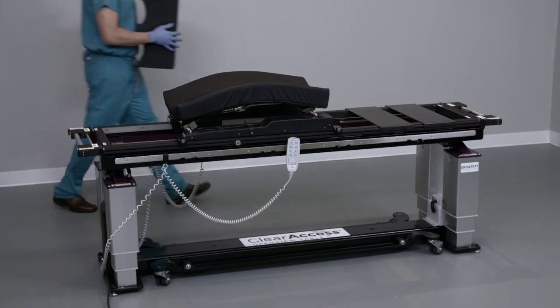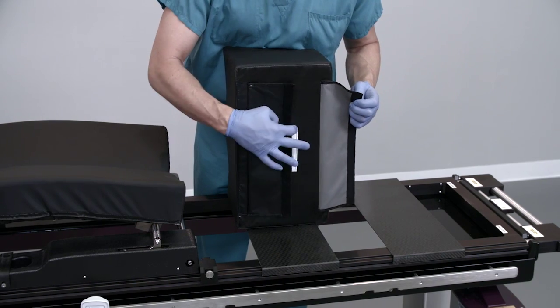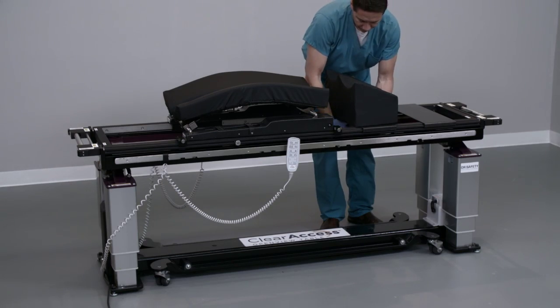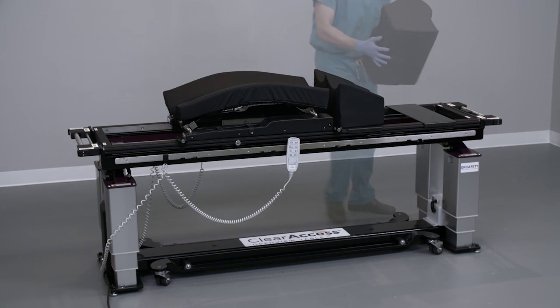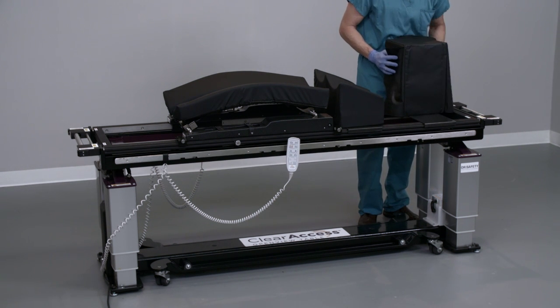The leg management system includes a thigh pad and an ankle rest. Install the thigh pad on the carbon fiber support closest to the FlexFrame by wrapping the flaps of the pad around the support and joining the Velcro underneath. Adjust the placement of the pad as necessary by sliding it toward the head or foot end of the table.